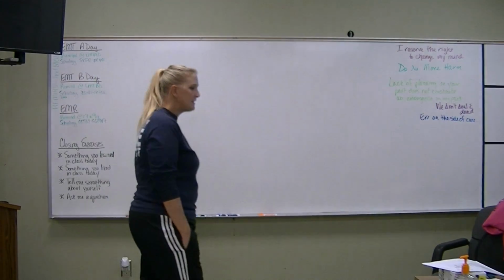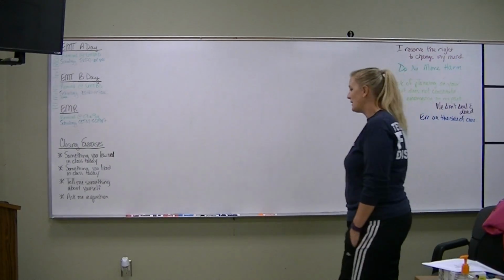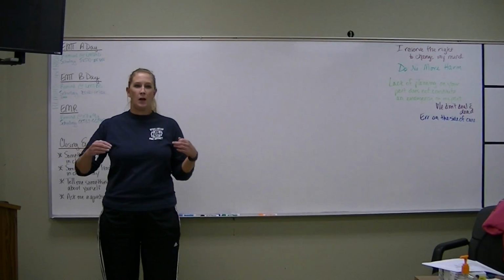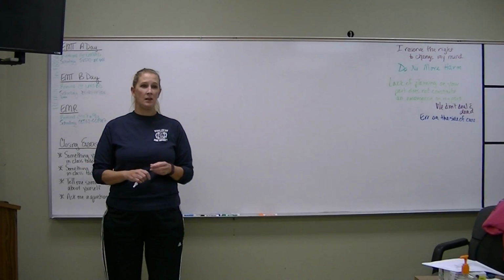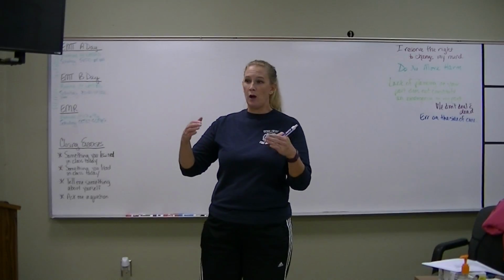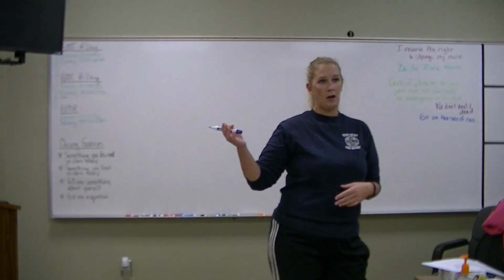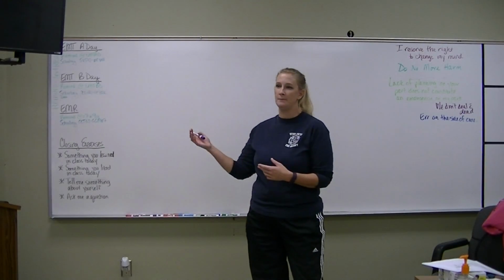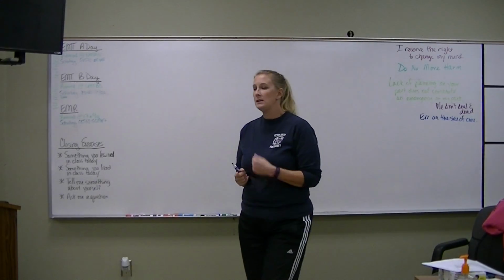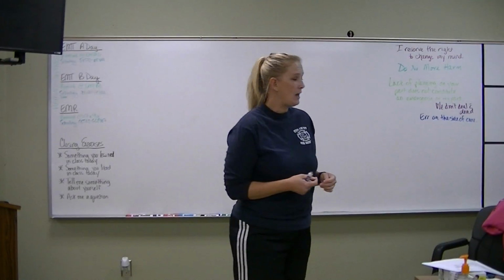In the course of any typical EMS call, you're going to have to lift and move patients a couple of times to get them where they're going. You're going to have to move them from wherever they're at when you get there to your stretcher, and from the stretcher, or not from the stretcher, but on the stretcher into the back of the ambulance, and from the back of the ambulance into the hospital, and from the hospital onto the bed. So we have at least 4 moves just there. If you have a patient who is somewhere where you can't get the stretcher to, there are other moves that you may have to use as well.